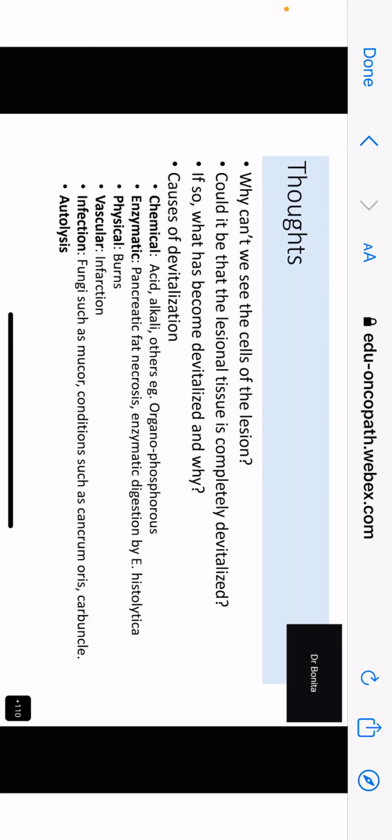Tell me. What did you think? Ma'am, I think inflammatory lesion of stomach, ma'am. You thought it was inflammation, good, but what was the cause? Infection. Ma'am, it is an inflammatory lesion of stomach. Necrotizing inflammatory lesion, excellent. The cause of which is infection. Fungal infection. Very good. So you thought it might be fungus. Excellent. So it is some kind of overwhelming necrotic lesion in the stomach, and we need to find out something more.